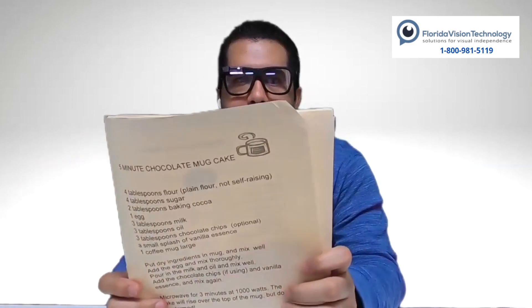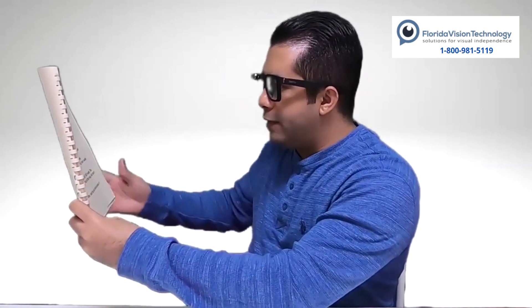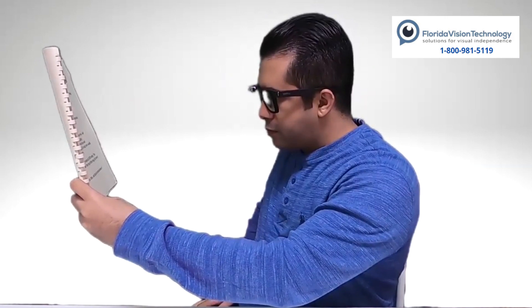I'm going to double tap to select, then swipe forward until I hear Scan Text — there it is. I have a recipe book right here that I'm holding up in front of the camera, about 12 inches away. I always like to use my nose as my pointer reference — wherever my nose points, the camera on my Envision Glasses should be pointing. I'm going to double tap on the touchpad to take a picture. You heard it beep twice — the camera shutter. Now it's processing that information.